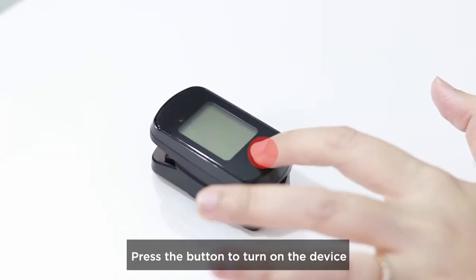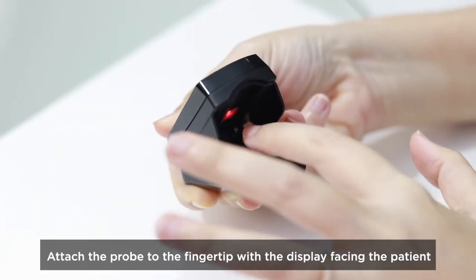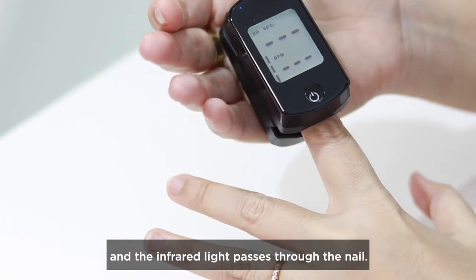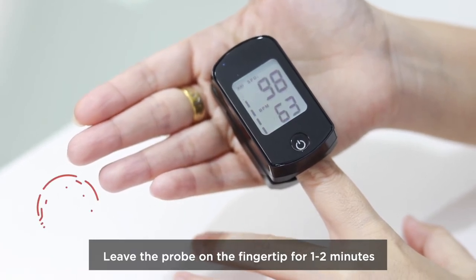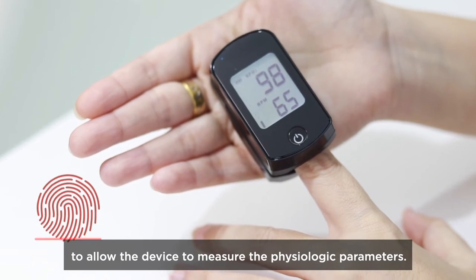Instruction. Press the button to turn on the device. Attach the probe to the fingertip with the display facing the patient and the infrared light passes through the nail. Leave the probe on the fingertip for one to two minutes to allow the device to measure the physiologic parameters.